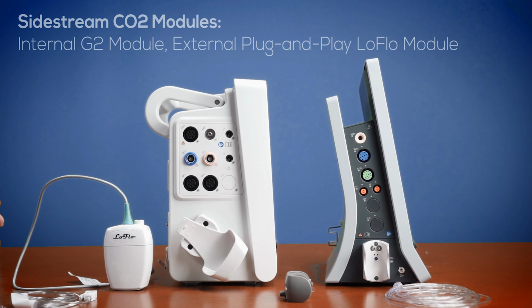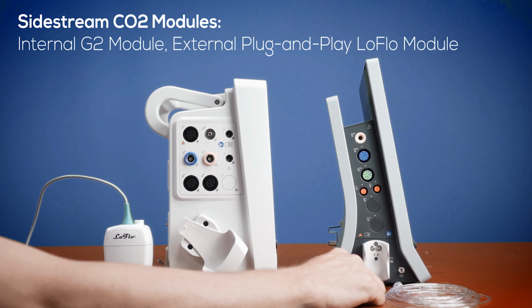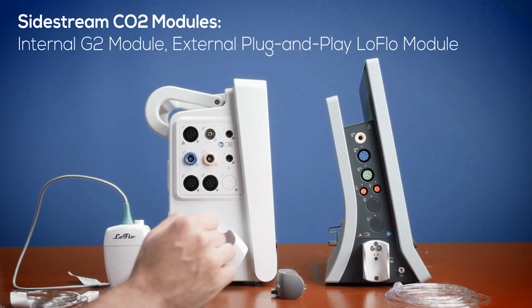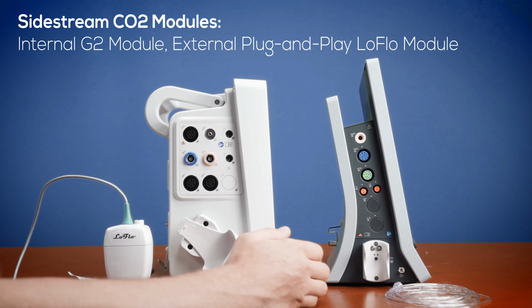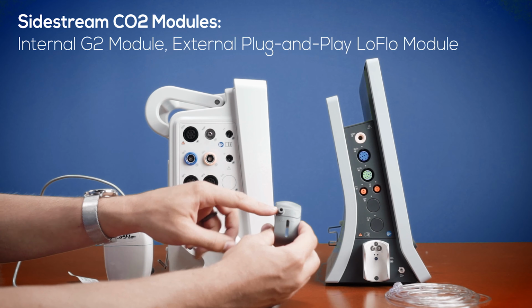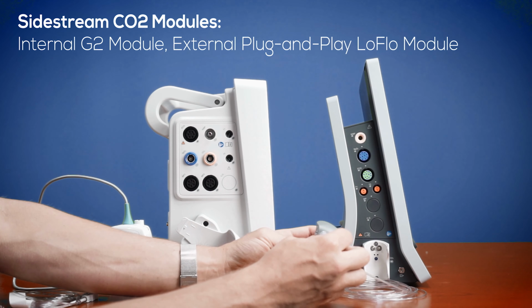For side stream CO2 modules, we have two options: the internal G2 module or the Philips Respironics low flow side stream module. The G2 series uses a traditional water trap and terminates in a female luer lock, so any generic male luer lock cannula can connect to it.